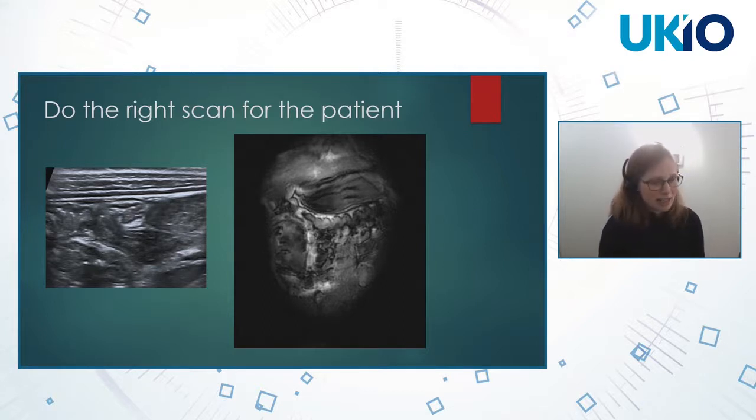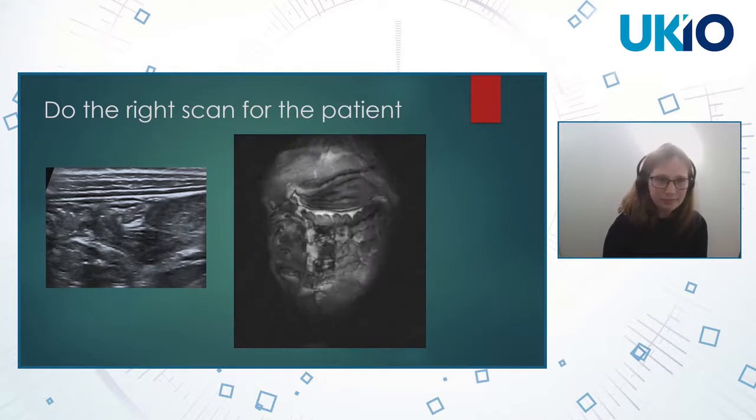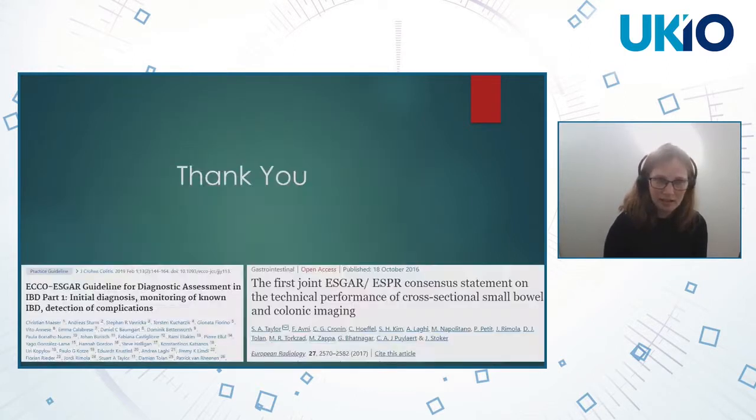And I would suggest that it is actually worth finding out which study they're best suited for, whether the patient tolerates MRI better or ultrasound better, if the patient has a particular preference for a particular contrast agent, and whether they are happy to tolerate buscopan. And if you can tailor your study to your patient, then that's how you're going to really optimize your imaging. Thank you very much.